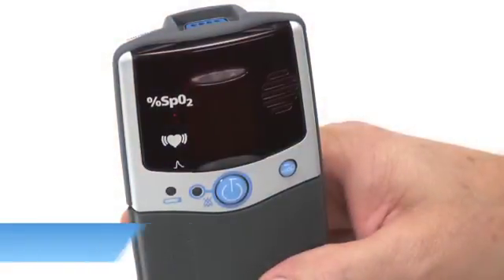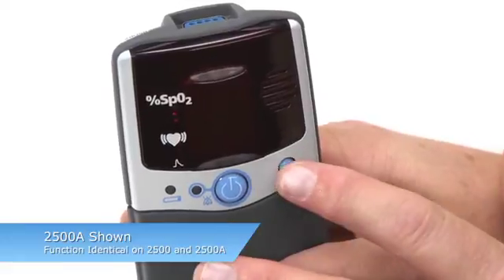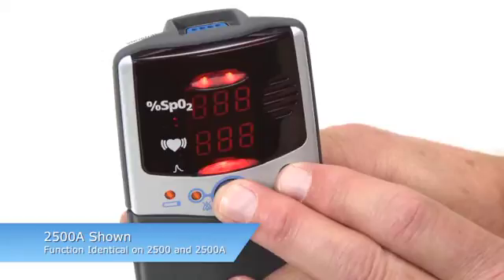To enter Setup Mode on the 2500 model, start with the oximeter turned OFF. Press and hold the ON-OFF button and ADVANCE button, and while holding the ADVANCE button, then release the ON-OFF button.